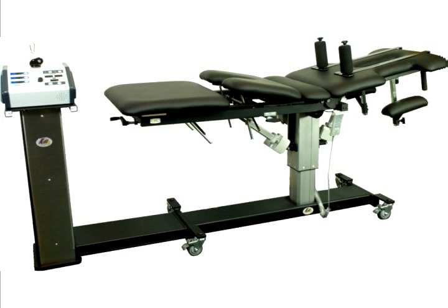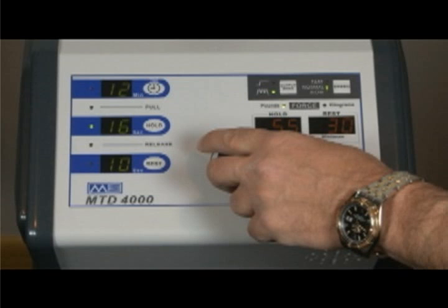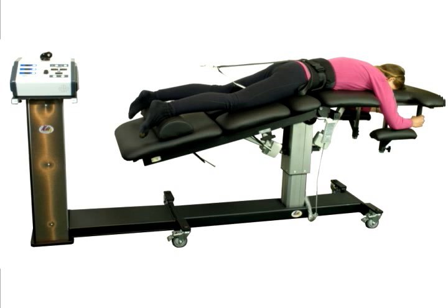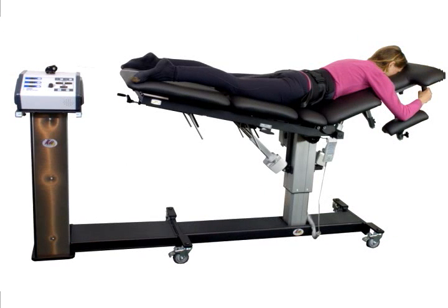The KDT NeuroFlex table includes the Mettler Electronics MTD4000 traction decompression head. The microprocessor-controlled MTD4000 provides cervical or lumbar traction by exerting therapeutic pulling forces on the patient's body with enhanced reliability and ease of use.